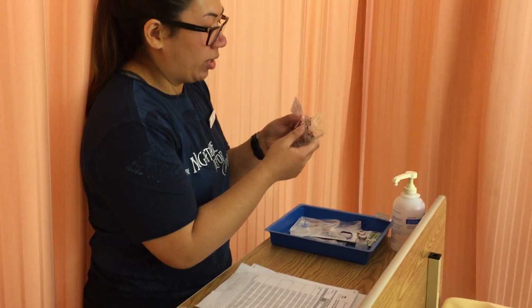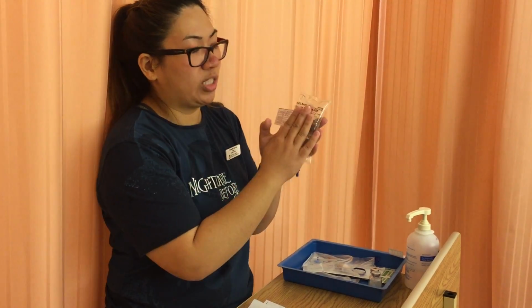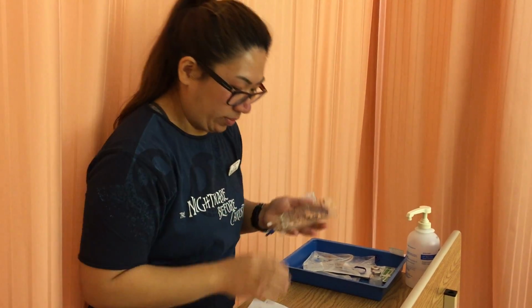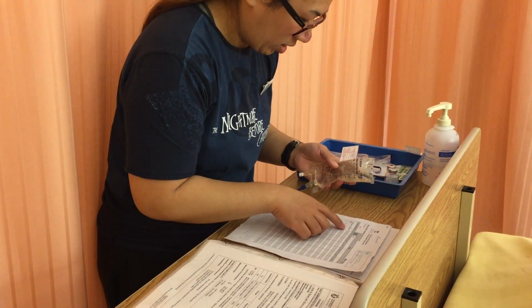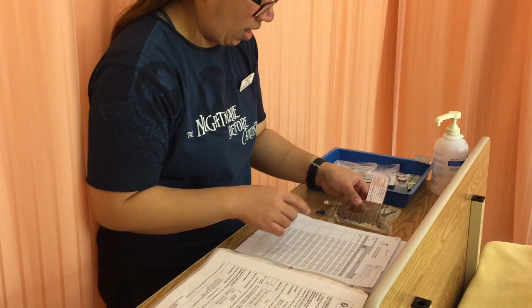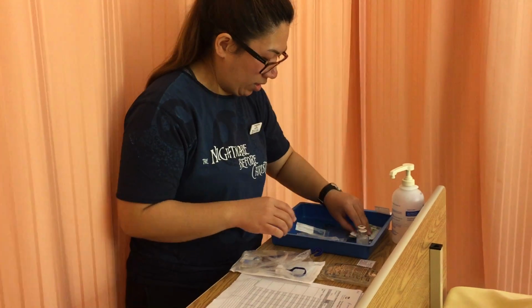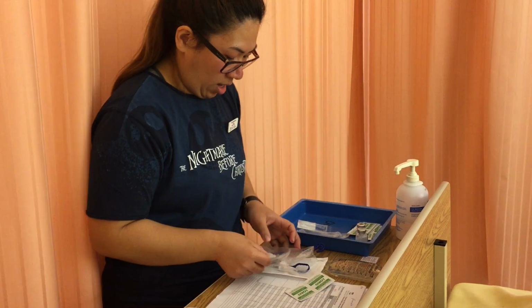I would put my label on the side as well so the other healthcare providers would see what's in the solution and what kind of medication is inside the solution. Ansley Medina, cefoxitin 750 milligrams, today at 1400 through an IV. I'm going to come back, and I have to get the other stuff ready: alcohol swabs and my label.